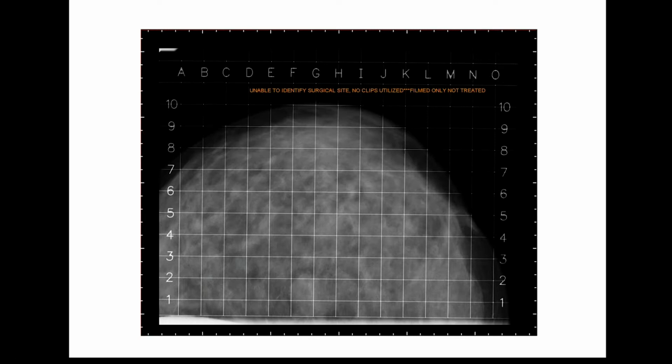We could not find a post-op change that we could reliably image here, but I have to tell you, it was no easier on CT scan trying to define what the tumor bed was to do electron planning. So some cases are just a challenge. Next slide.